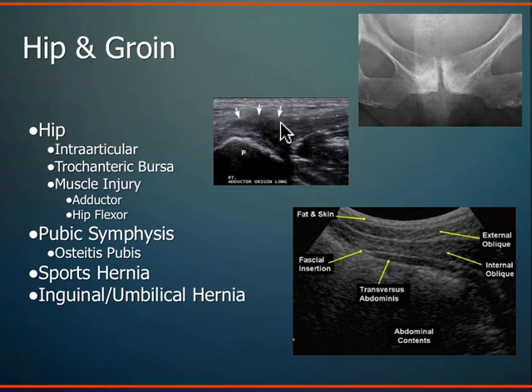In the groin and the hip is an area where MRI is traditionally less reliable, and it's very hard to image some of these subtle muscle weaknesses or muscle fascial herniations. And there's things like sports hernia, which is this very nebulous topic where you could have pathology involving either hernia structures or muscle tears or tendon tears, and a lot of different things that can happen in sports hernia that very traditionally is not imaged on MRI, but we see very well with ultrasound. And these are some of the muscle tissues that sometimes can be involved in sports hernia that you can see quite well with ultrasound.